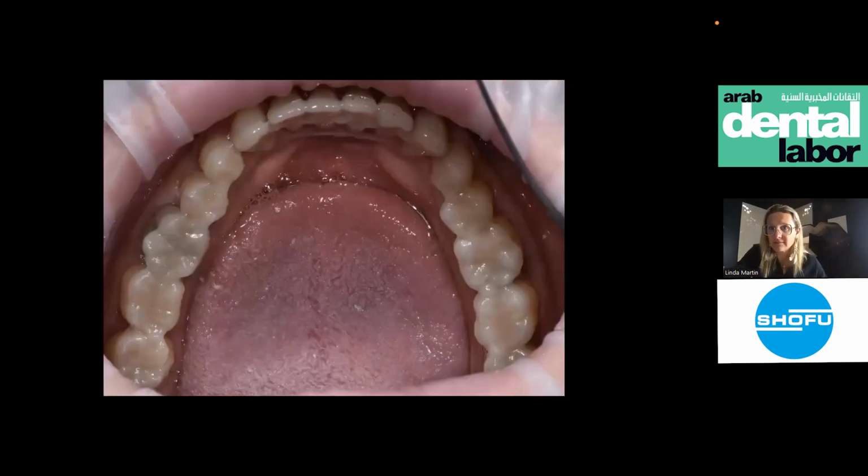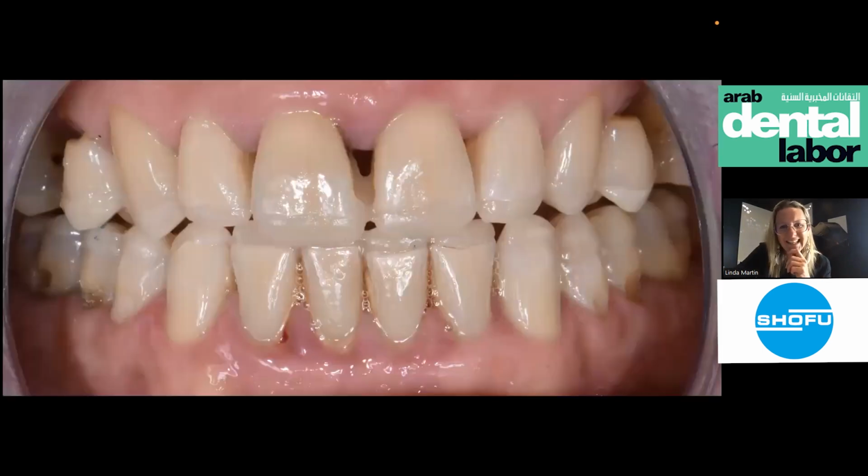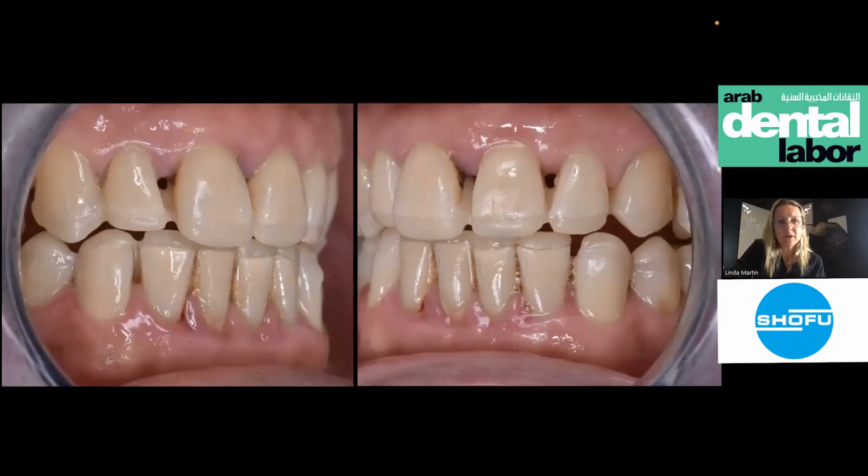We put it tooth by tooth. And the lower edge, okay? In the back, we can see there are three different composites. So Olivier can go back home like that. We just do no preparation, just etching, drying, bonding. It's okay. You can see on the left, on the right, just bonding.